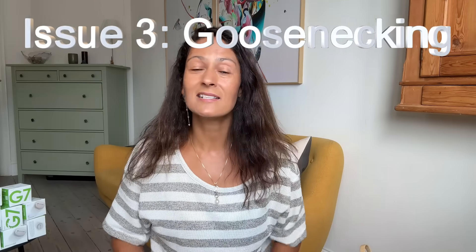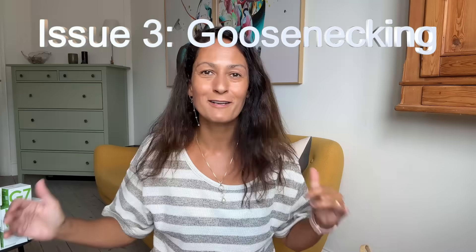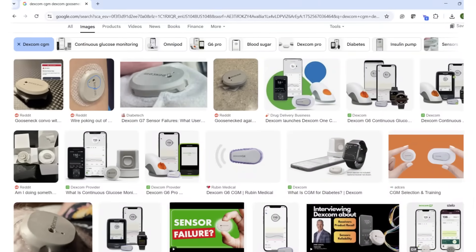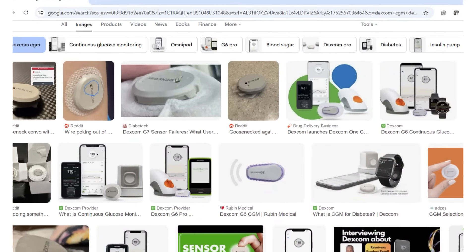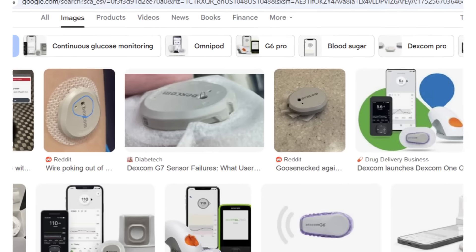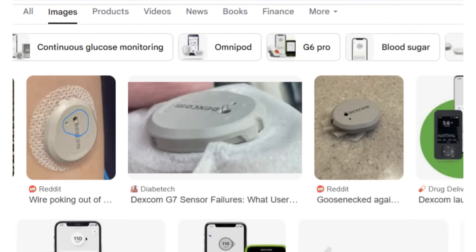Another Dexcom G7 issue I see popping up across social media is goosenecking. If your sensor won't connect, is failing, or just acting weird, look closely at that little hole in the sensor — is that little wire sticking through? If this happens to you, all you can do is document it. I would take a photo of it and reach out to Dexcom to get a replacement.